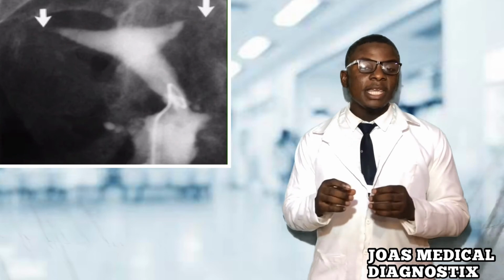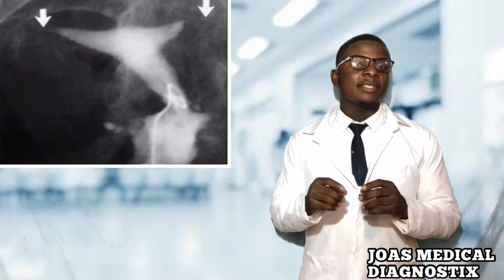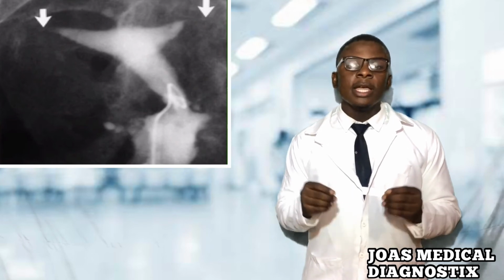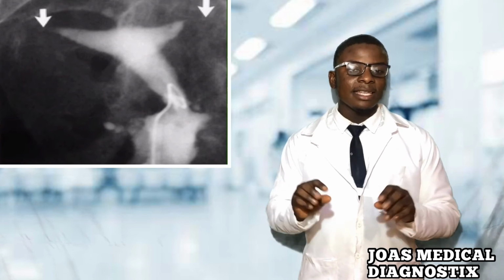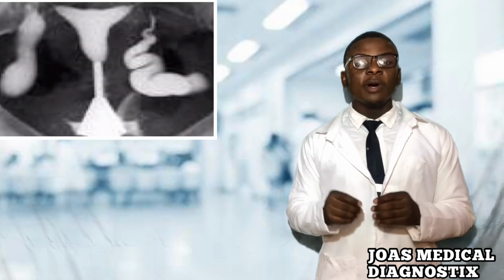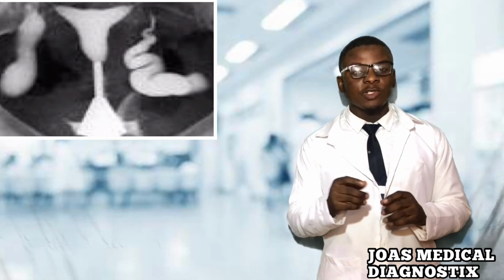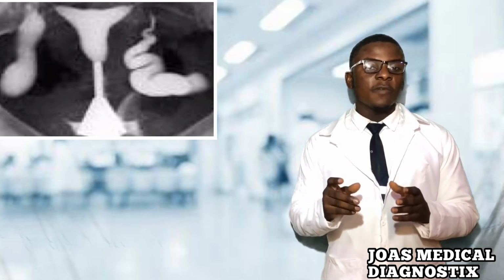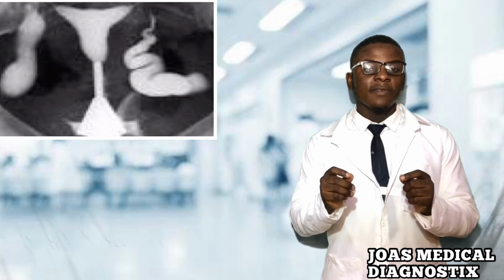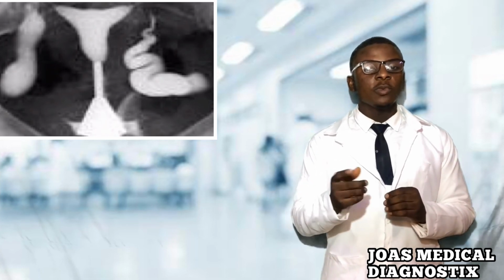Here, we see a patient who has bilateral proximal tubal occlusion as identified by the arrows. The uterus is of normal shape and contour, but no dye is seen getting into the fallopian tubes. Our last image is of a woman who has had pelvic inflammatory disease and now has bilateral hydrosalpinx, as seen by the very large dilation of the ampullary portions of the fallopian tube on each side. This is a common cause of tubal infertility.